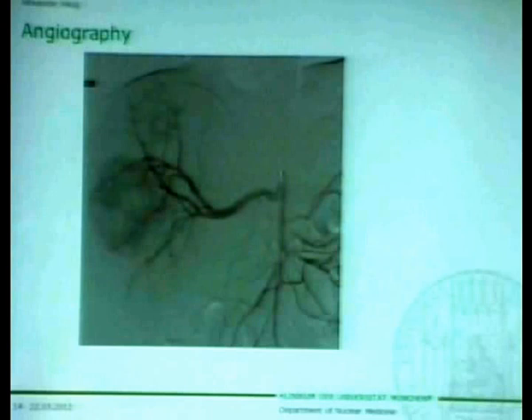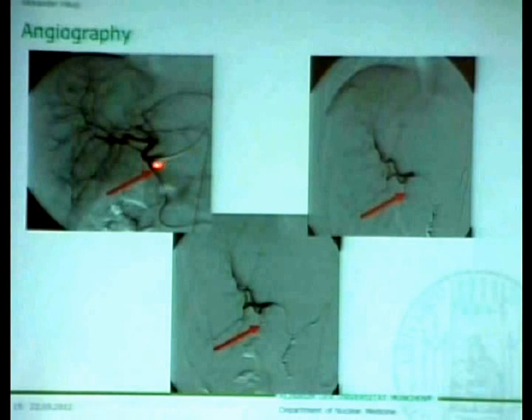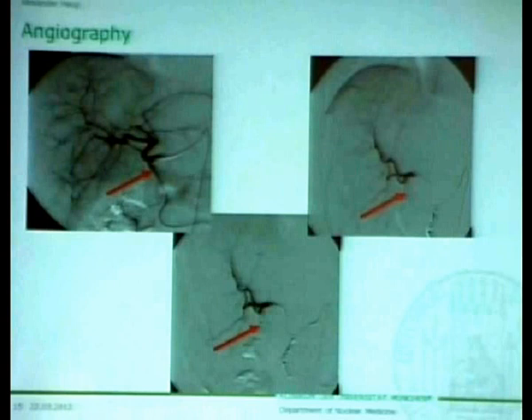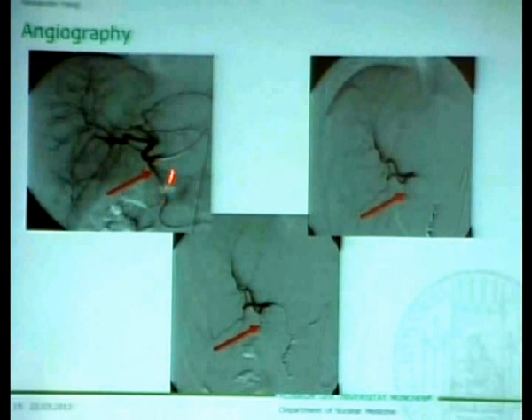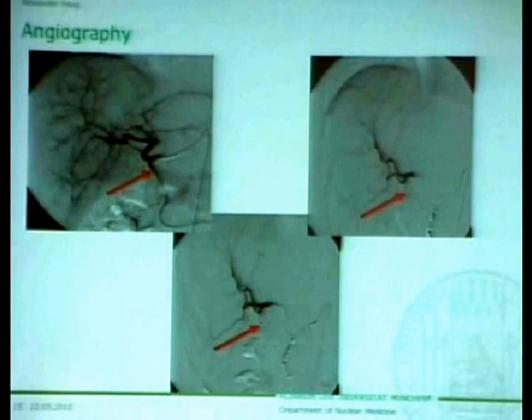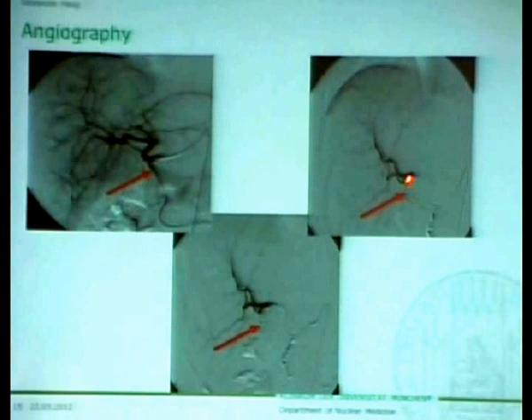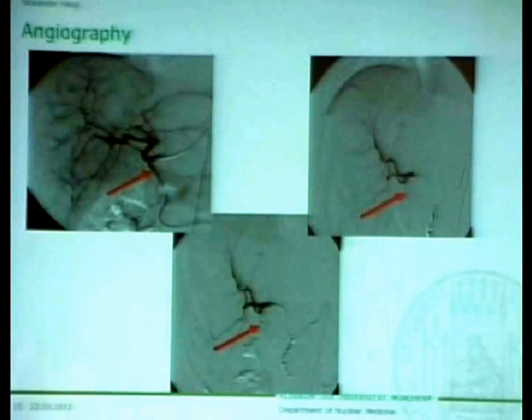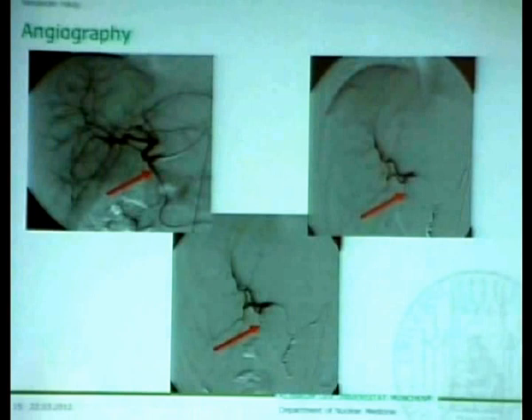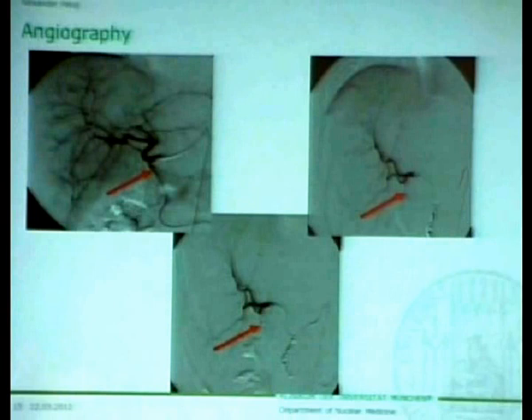This is a more common example showing the main hepatic artery and the gastroduodenal artery supplying the duodenum and pancreas. We have to coil the gastroduodenal artery to prevent reflux flow to the duodenum in case of hepatic flow reversal. There is also a small cystic artery which I recommend coiling as well, despite the risk of the patient developing ischemic cholecystitis. After coiling these two vessels, radioembolization can be done safely.